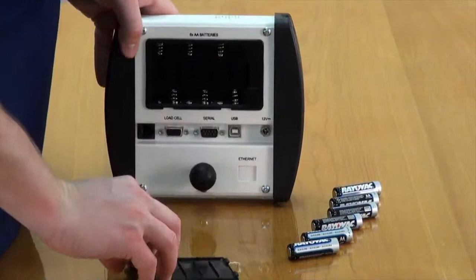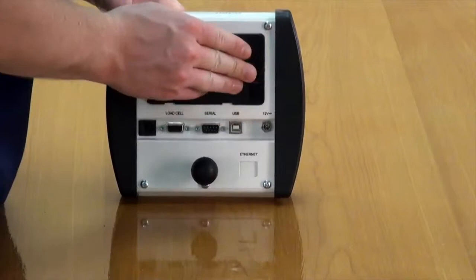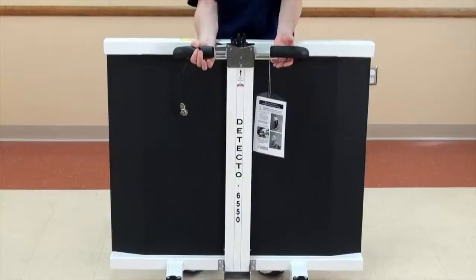To install the batteries, simply remove the battery compartment cover on the back of the indicator, insert six AA batteries, and replace the cover.